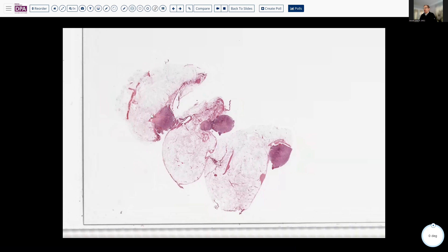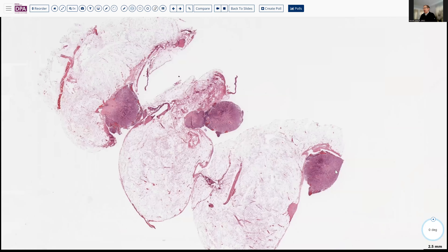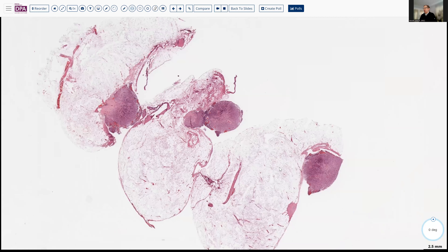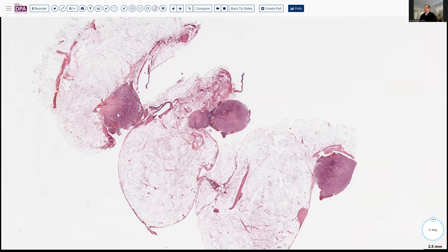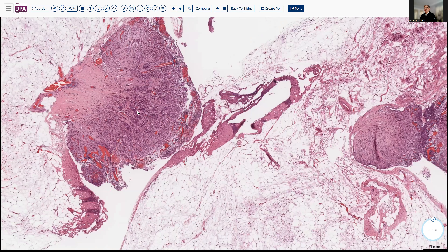As you can see here at low magnification, these nodules are quite small, each on the order of probably less than a millimeter in total size. And thus, these would not be usually visualizable on imaging studies, and hence discovered incidentally at surgery. Notice that they have somewhat of a lobulated, stuck-on appearance with a little invasion of the underlying fat, and you can see they do have a sort of infiltrating contour with some associated inflammatory cells.